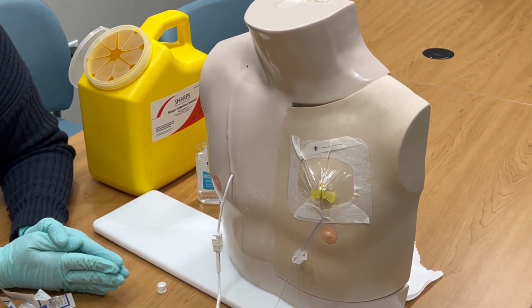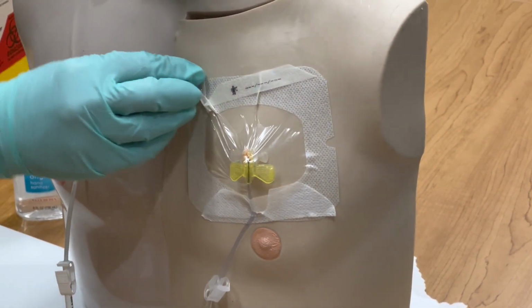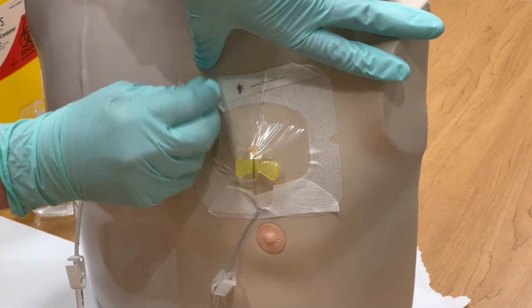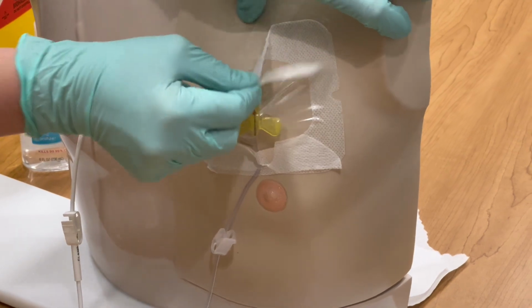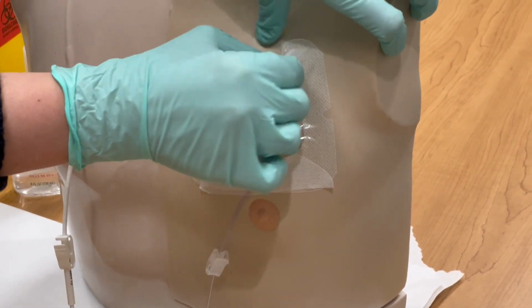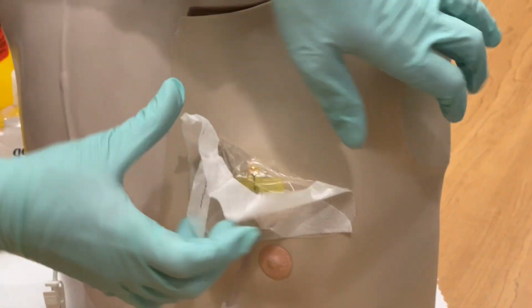We're ready to take off the dressing and remove the needle from the port. You're just going to carefully remove the dressing. You can apply counter pressure against the skin to help it lift up.